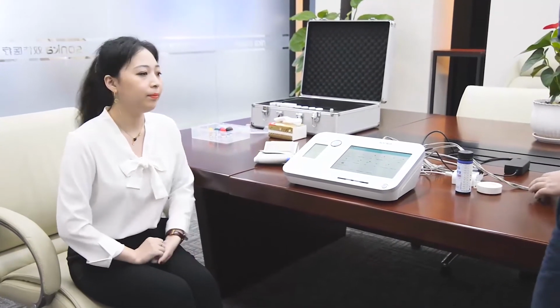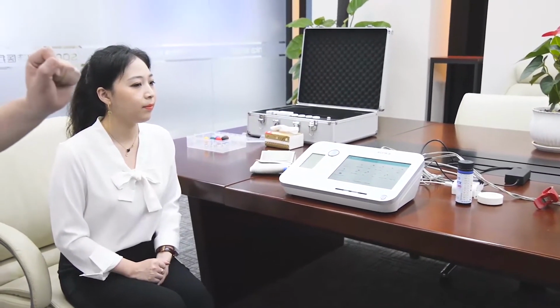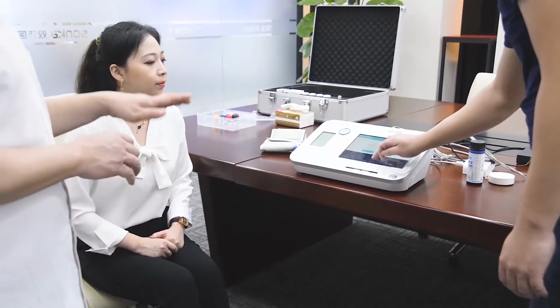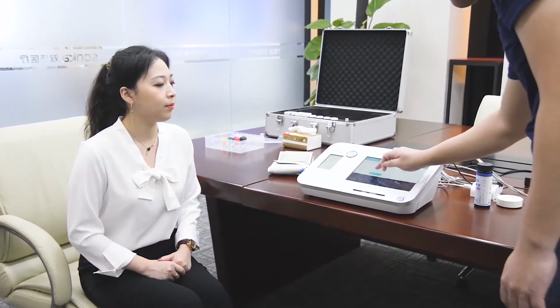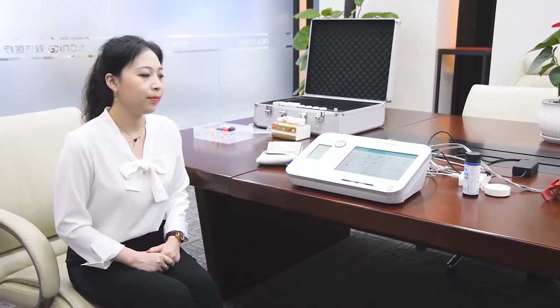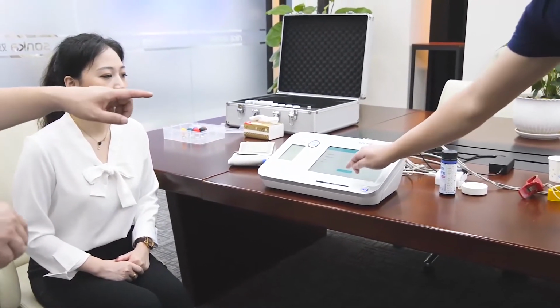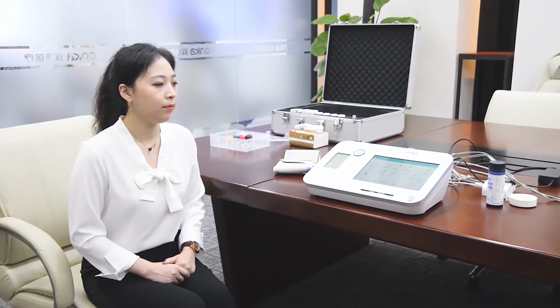For the next step, we can input the vision result. Here, we don't need to test, but we input the result in the software. Left eye and right eye, input the result and store it. That's it. Next one is teeth examination. The same as we just input, you can choose the condition of the tooth and press save.